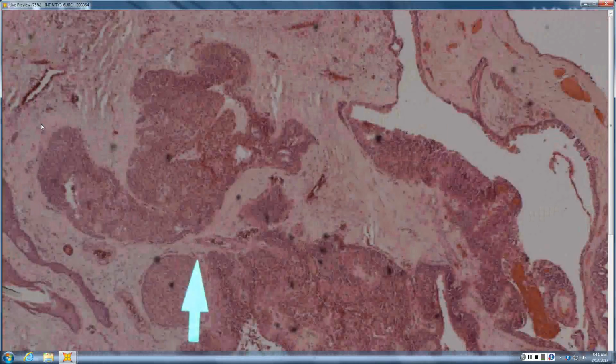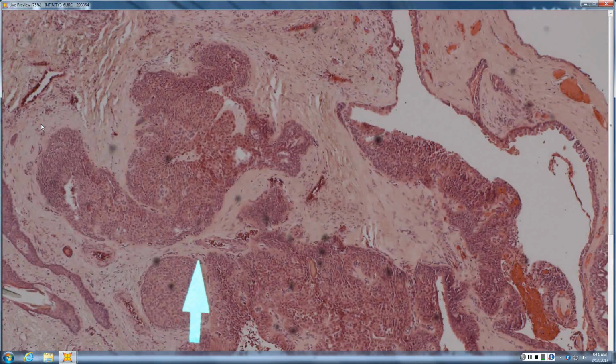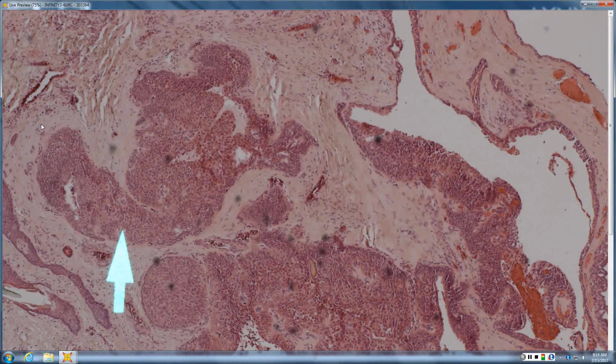So, very pink cells. So are you thinking inflammatory or neoplastic? Probably. And if it's neoplastic, this is pink, and you got little white circles, so what would be pink with ducts? Like any kind of, just in that group. Yeah, acrospiroma group.